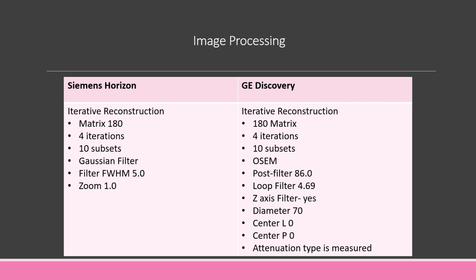So these are the recommendations that come from Cerianna directly when the drug was released. So you may want to work with your manufacturer if you have a different camera or you're unsure of how to set that up and you're starting FES imaging for the first time. I do not have the parameters for any other scanners, so at that point you would also want to contact the camera manufacturer to get assistance in setting up that protocol.